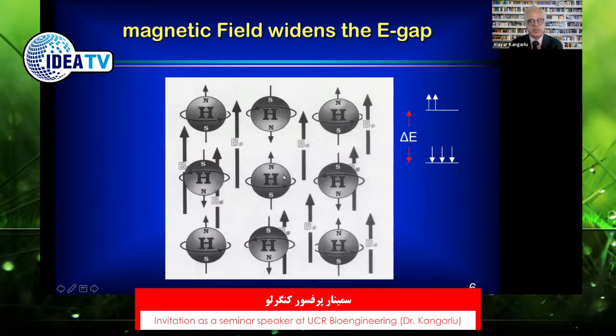Actually, lining up is not the right name, because some of them will be pointing in the direction of the magnetic field, some of them will be pointing in the opposite direction. And the population of what we call parallel and anti-parallel protons will be roughly equal. So, and I underline the word roughly, they're not exactly equal. There are more protons pointing in the direction of the magnetic field than in the opposite direction, because it takes energy to oppose the strong magnetic field.